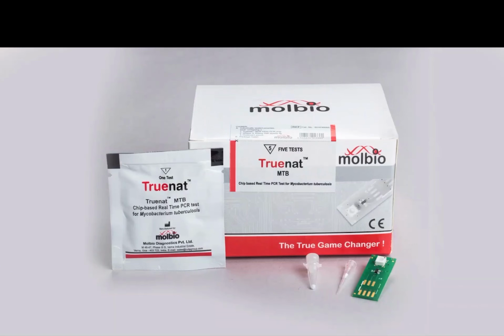With that you have a small PCR tube, and in the bottom of the PCR tube, if you notice, there is a small white thing. It is like the small balls of homeopathy medicine. The master mix which I was telling you about, which contains DNA polymerase, primers, etc., is all condensed into this small white ball. That is very important.